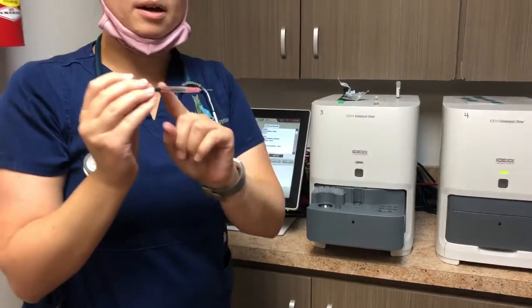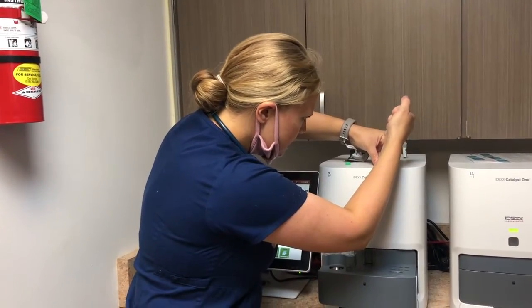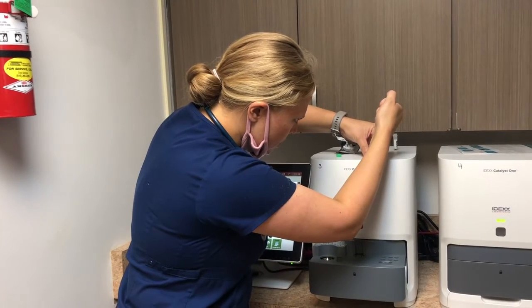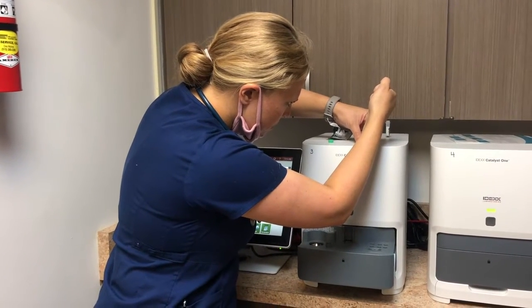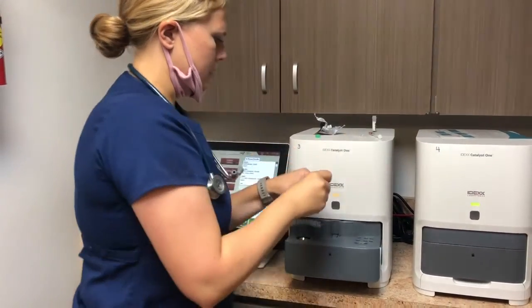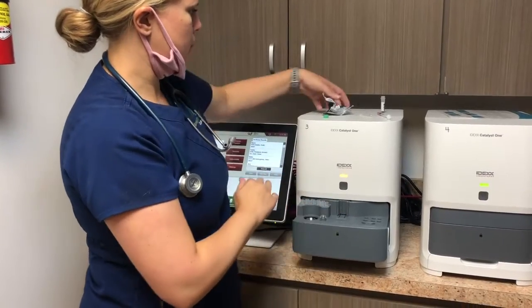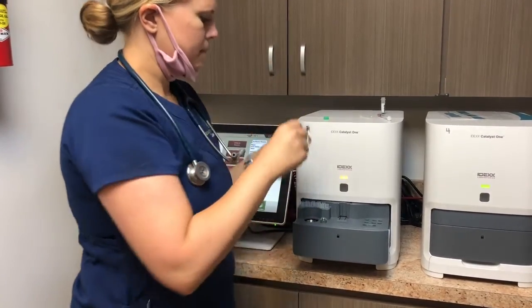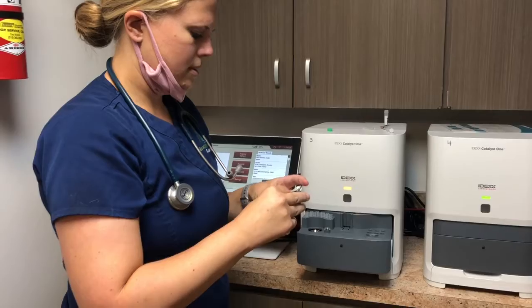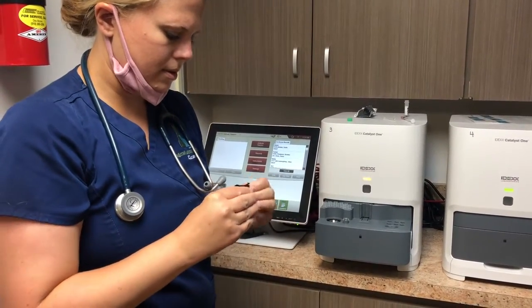And then I'm going to insert our serum into our sample cup here. It's got some pre-marked lines for me that I just kind of aim to go between them. And I'll set that in the tray. I'm going to make sure that I've got enough of these sample pipettes here. And then I've got our pre-treated slide clip.